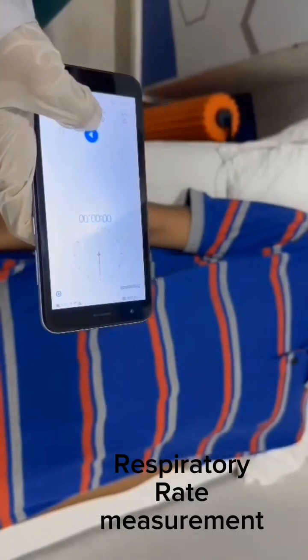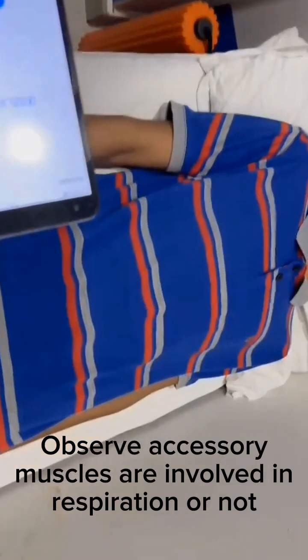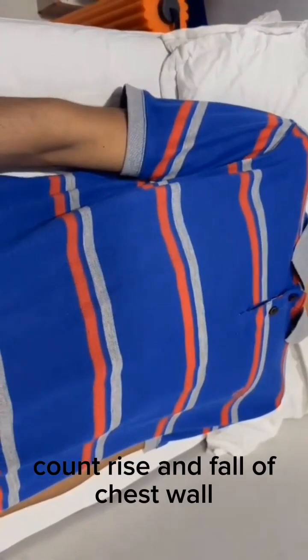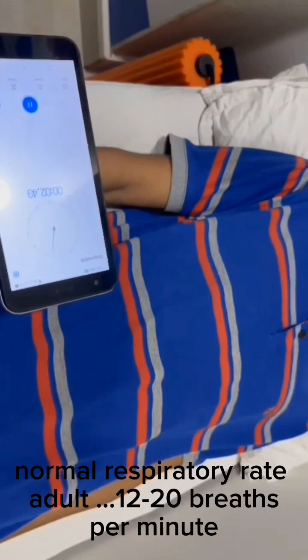Today I will discuss respiratory rate measurement. Stopwatch for counting. Count the rise and fall of the chest wall. Observe whether accessory muscles are involved in respiration. Observe the patient's breathing pattern. One rise and one fall is equal to one respiration.